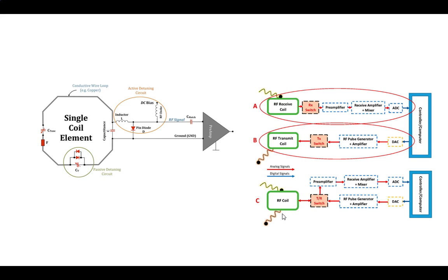Then I have an inductor and this matching one, because this is at 50 ohms and this isn't. So I have to adjust between my coil and my amplifier's input to get a good match, so I don't have a problem with signal reflectance and all kinds of fun stuff like that. The remaining two here are what are called the detuning circuits, and these are basically to prevent the accidental pickup of that initial powerful kick.